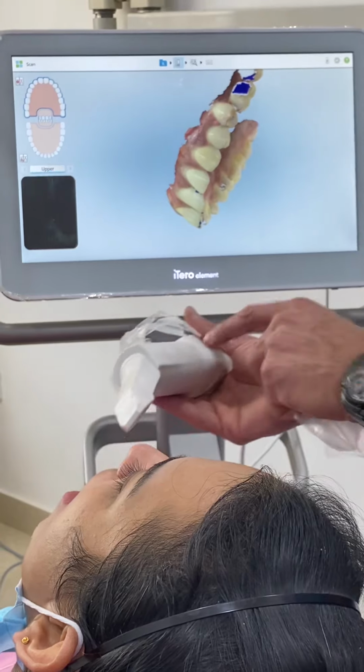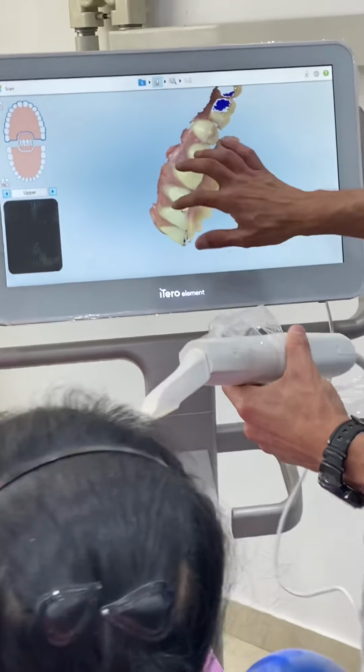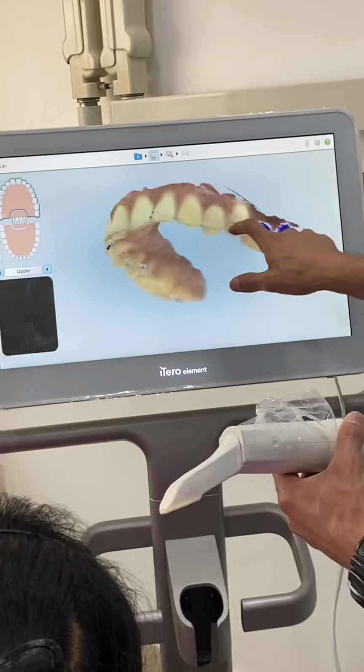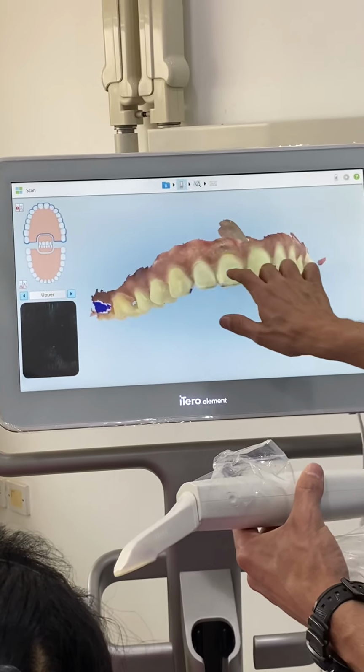So if I push a bit forward, she'll be in real pain. But yeah, you get the idea. It's obvious. The same theory: the blue dots, the major ones you rescan, the small ones you can let go.